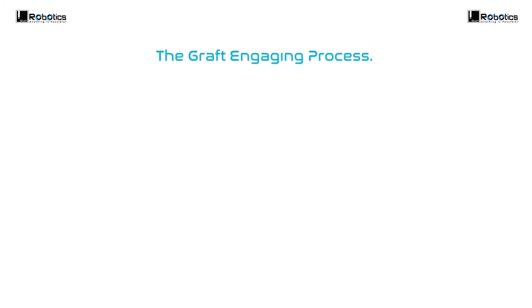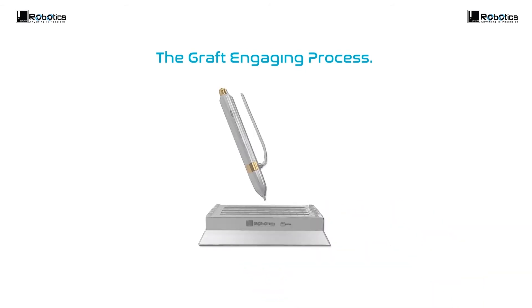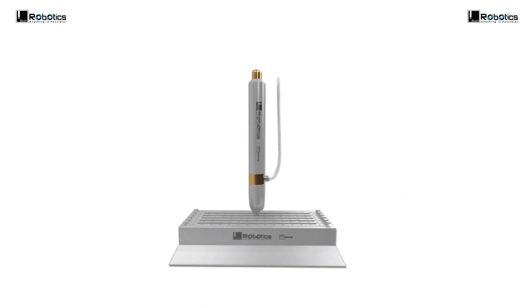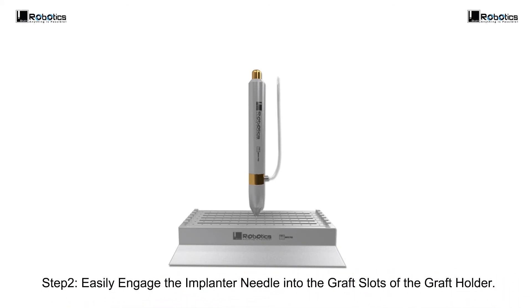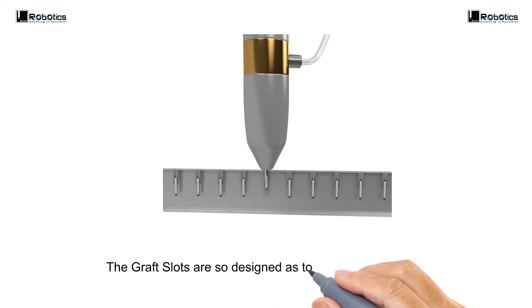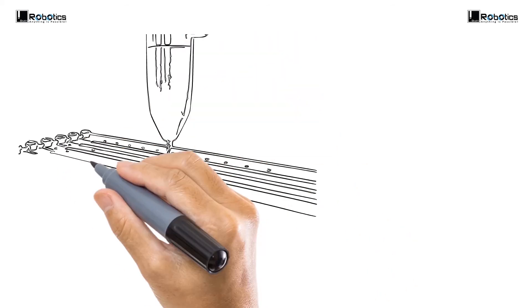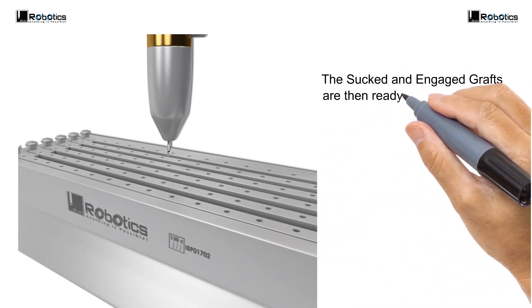The graft engaging process. Bring the implanter to the graft holder. Easily engage the implanter needle into the graft slots of the graft holder. The graft slots are designed to perfectly engage the implanter needle and easily suck the graft into the implanter. The sucked and engaged grafts are then ready for implantation.